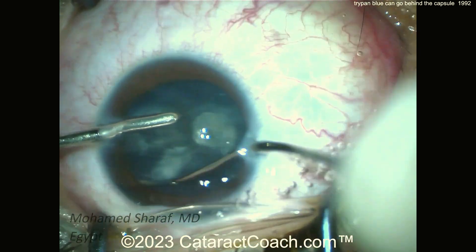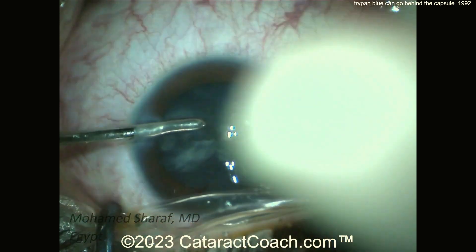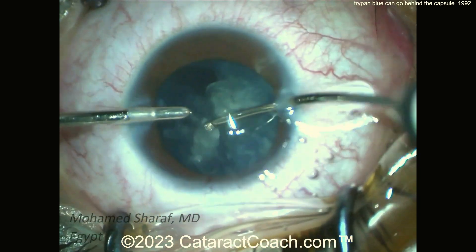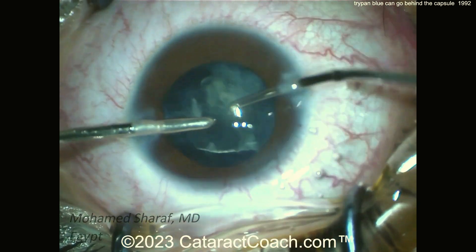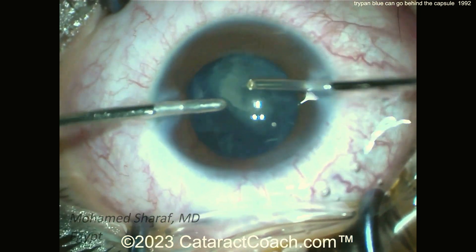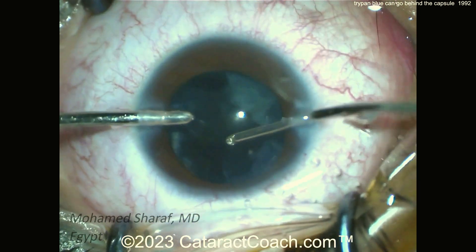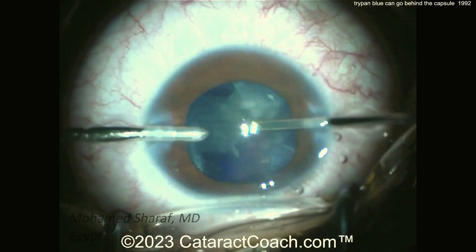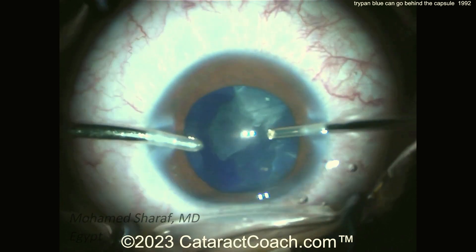The video has been sped up to be efficient in our learning. Where's the red reflex? No red reflex — it makes the surgery a lot tougher. Now I understand why some surgeons, especially in a trauma case, avoid injecting a lot of trypan blue dye in the eye. Instead, they use a bubble and paint just a tiny bit — though that's still no guarantee.